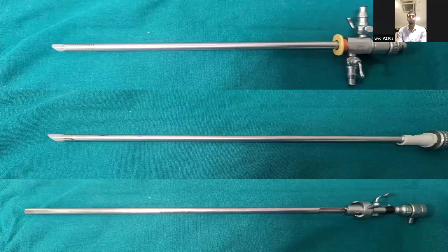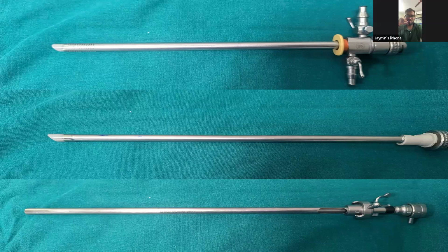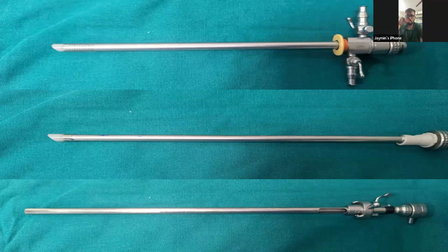Have you seen a Reuter's cannula? No, sir. It is like an IV cannula, a metallic tube with multiple holes on the tube, so that the tube doesn't get blocked. Yes, sir.